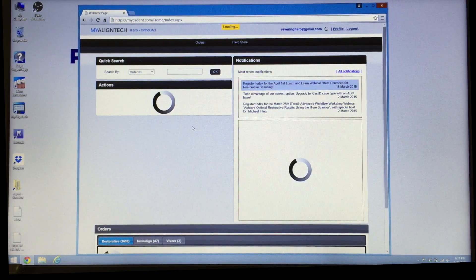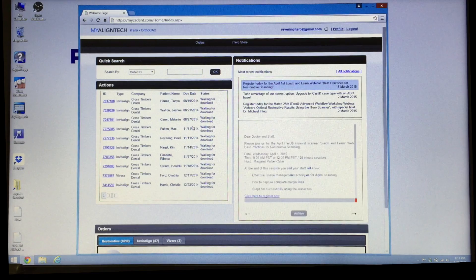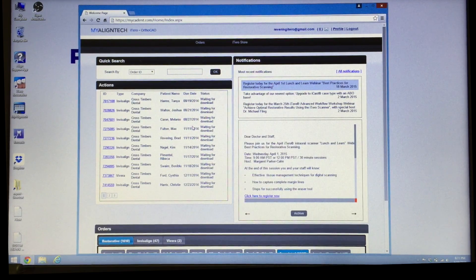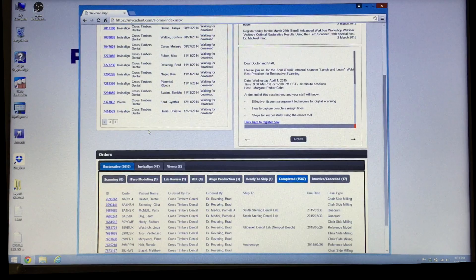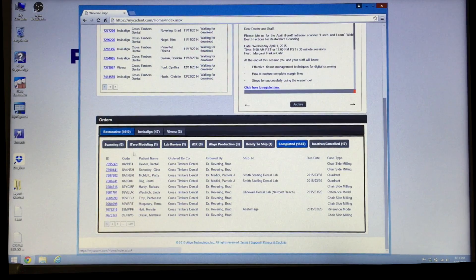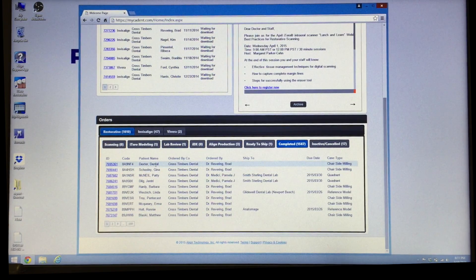I clicked on the web browser and it pulls up my Align Tech website, which is the mycadent.com website. We'll scroll down to which case we want — in this case the patient's name is Dexter Dental.